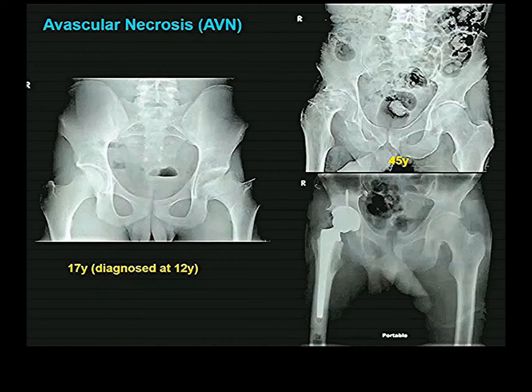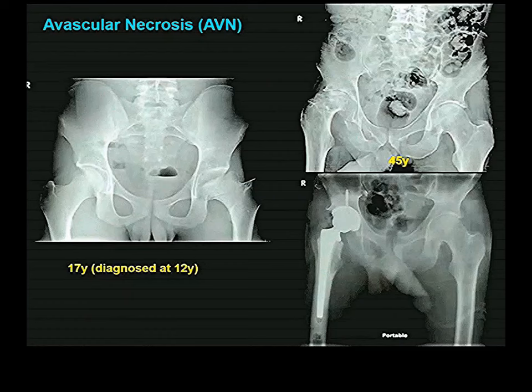Here is avascular necrosis of the left femoral head in a young boy — idiopathic, with no known cause. Here is avascular necrosis of the femoral head in an older person, cause not specified. When you have avascular necrosis there, they simply replace the end of the femur.